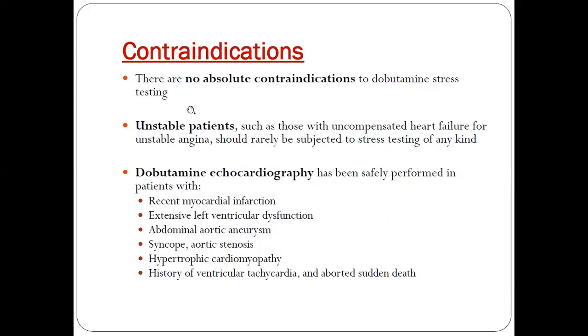What are the contraindications for Dobutamine stress echo? There is no absolute contraindication. Unstable patients are those with uncompensated heart failure or unstable angina. Dobutamine echo has been safely performed in patients with recent MI, extensive left ventricular dysfunction, and abdominal aortic aneurysm as well.